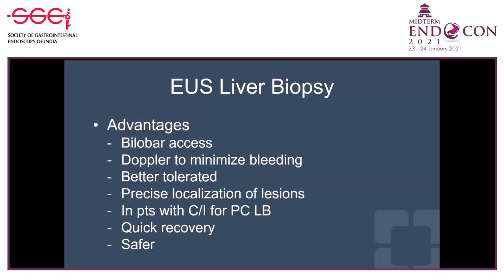And we can also perform endoscopic ultrasound-guided liver biopsy in patients who may have a contraindication for percutaneous liver biopsy, like ascites. It also allows for quick recovery, in contrast to percutaneous biopsy, where the recovery period often is 4 hours long. And I would dare to say that this is safer than percutaneous liver biopsy.